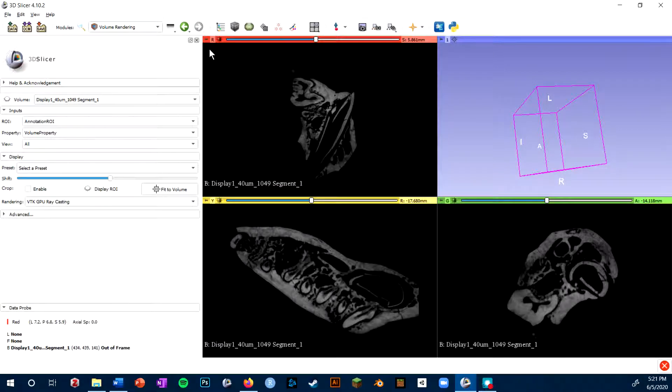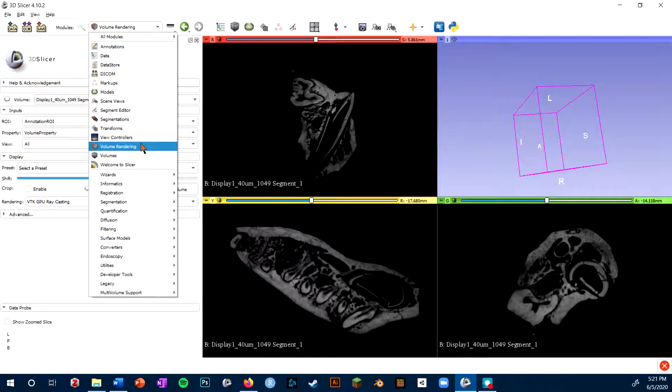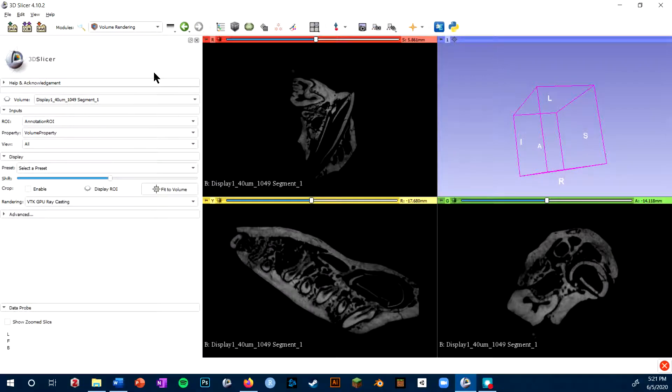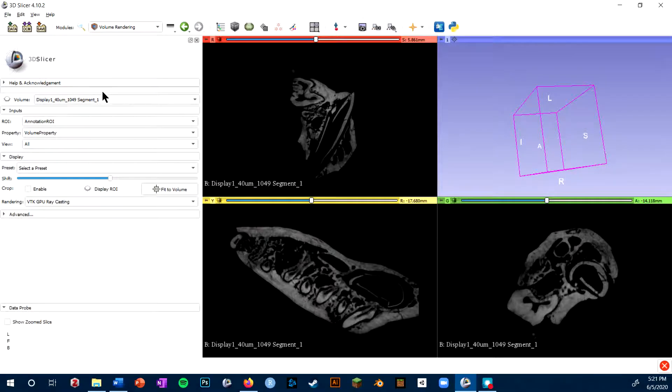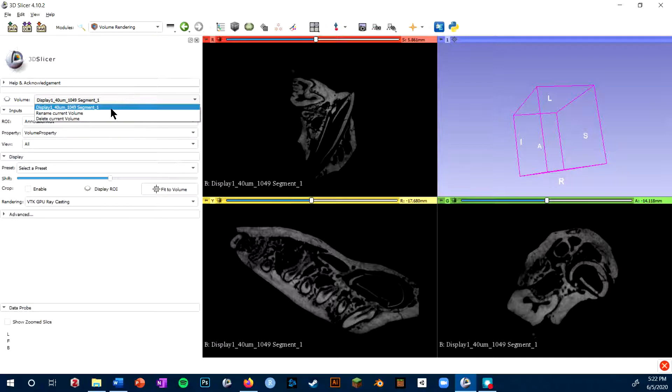To render a volume, you'll go to the modules menu and select the volume rendering module. I have it pulled up on the left here. First, you want to make sure the volume you want to render is selected in this top menu. I only have one volume in the scene, so it will be selected automatically.